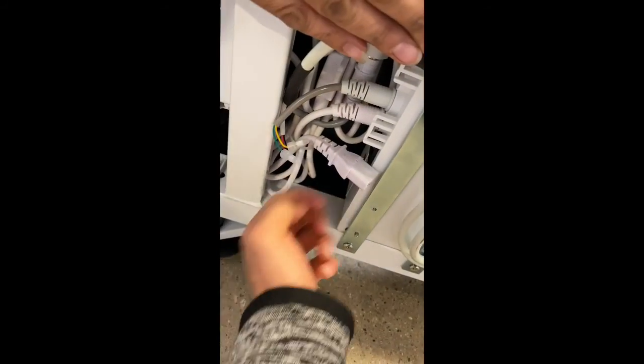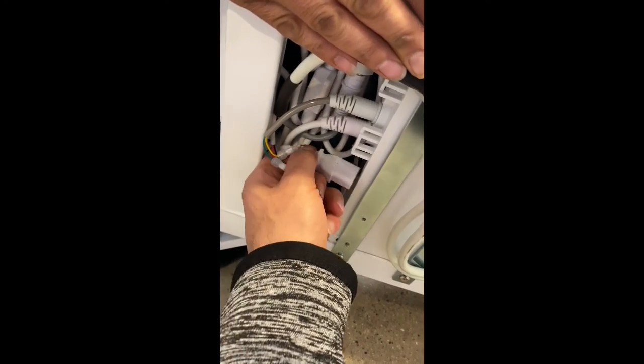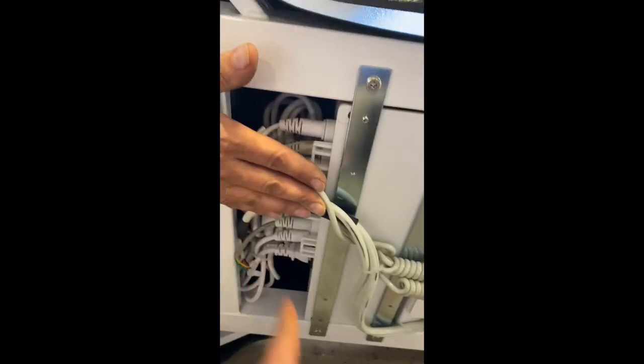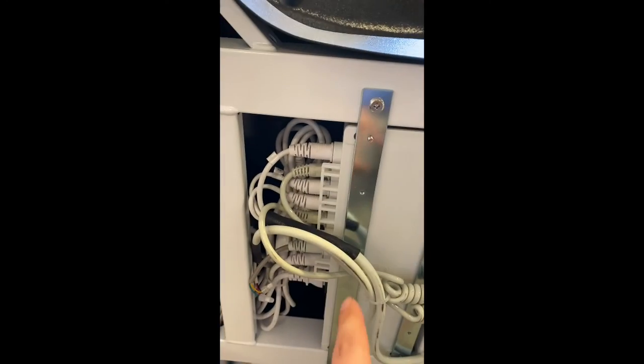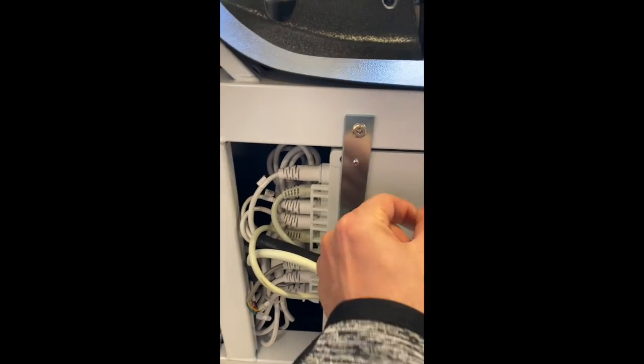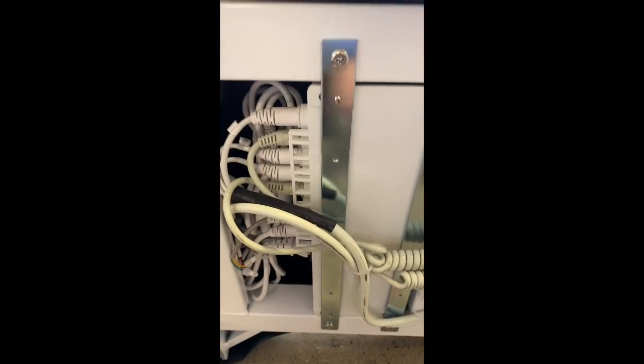You want to take it out and let it reset for about 20 to 30 seconds, then go ahead and put it back in. You should be hearing a sound. If there's no sound coming, then most probably the problem comes from the actual module box.